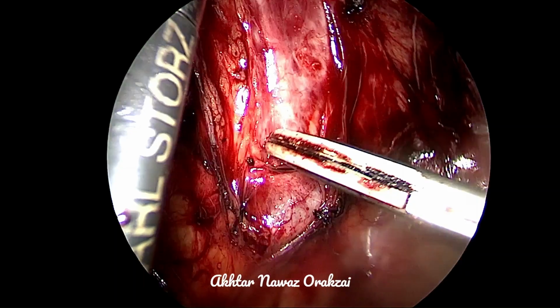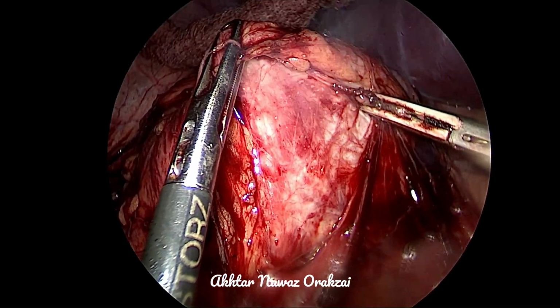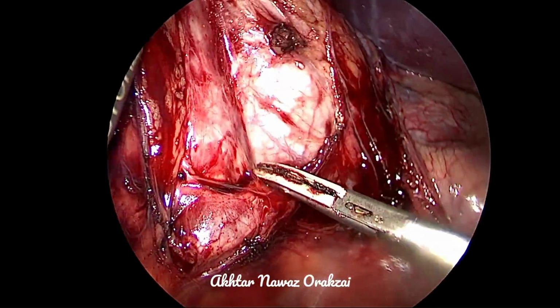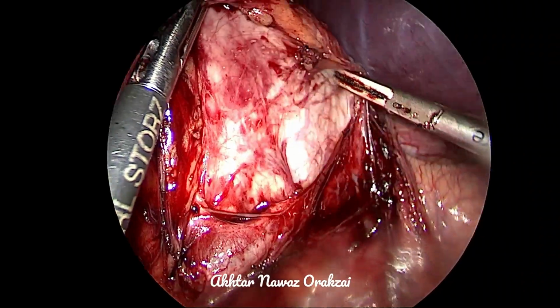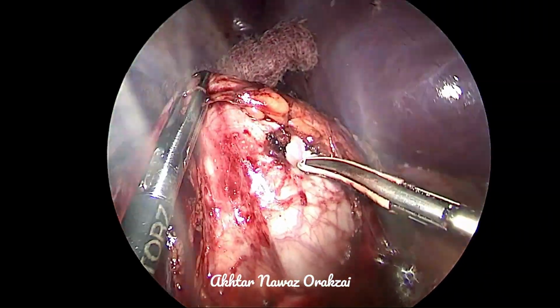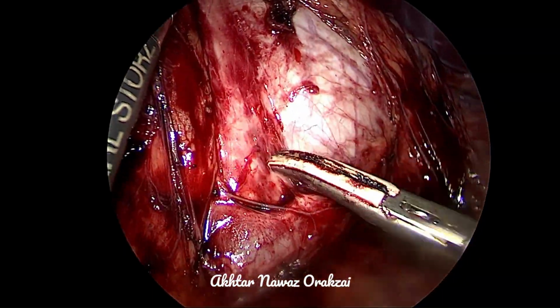We didn't place any ureteric catheter or the DJ stent because that would lead to decompression of the pelvis, making the subsequent dissection and identification difficult. However, it can make the identification of the ureter easy. So we decided to go for the pelvis first.